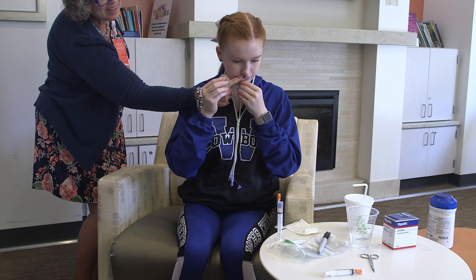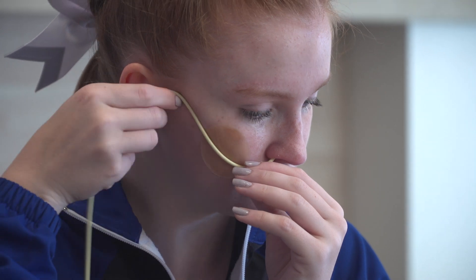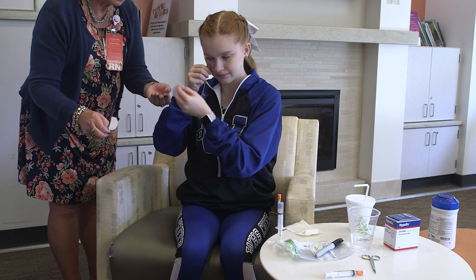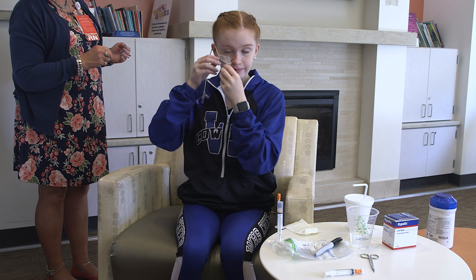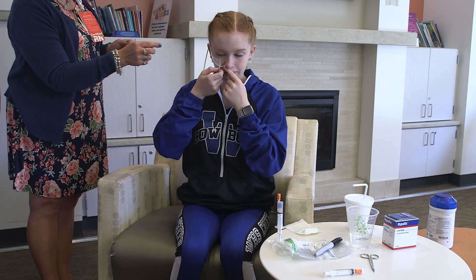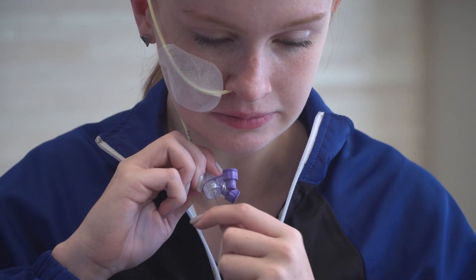Secure the tube by placing the tube over the duoderm, then applying the Hypofix tape, or however best meets the patient's needs. Withdraw the tube immediately if the child's color becomes blue or they develop breathing problems — this is a sign that the tube may be in the child's lungs instead of their stomach.